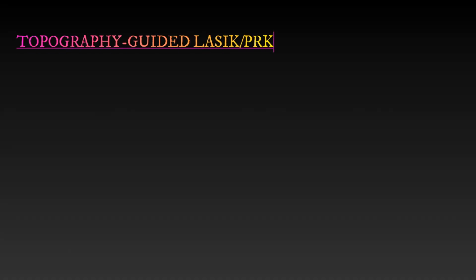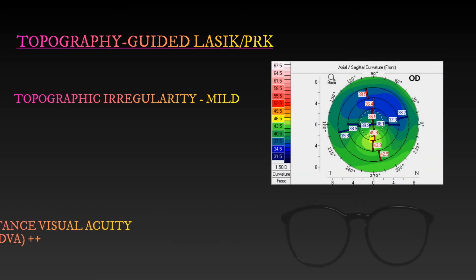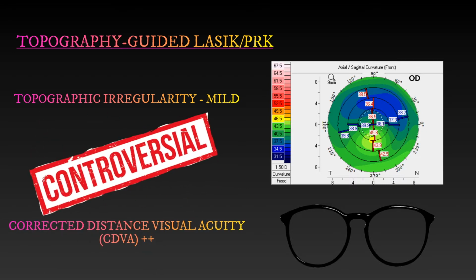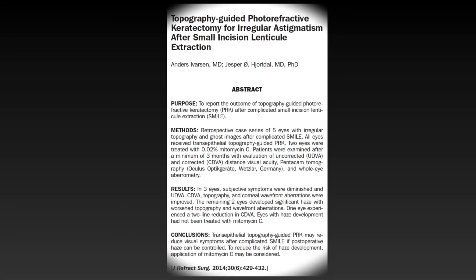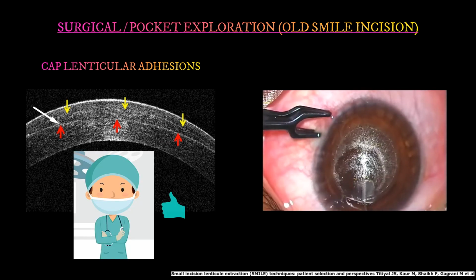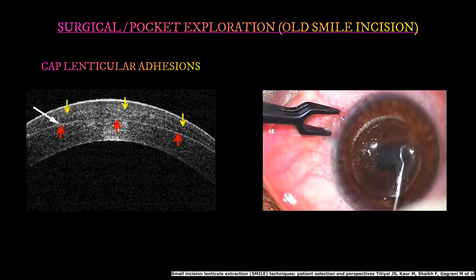Topography-guided treatments may be attempted in select cases wherein the irregularity is mild and the CDVA shows significant improvement. However, their role in this scenario remains controversial due to unpredictability of results and potential risk of haze formation. Surgical exploration of the pocket through old SMILE incision is indicated in those cases of cap lenticular adhesions where the surgeon is confident in exploring the pocket to remove the stuck lenticule in order to maintain the advantages of SMILE.